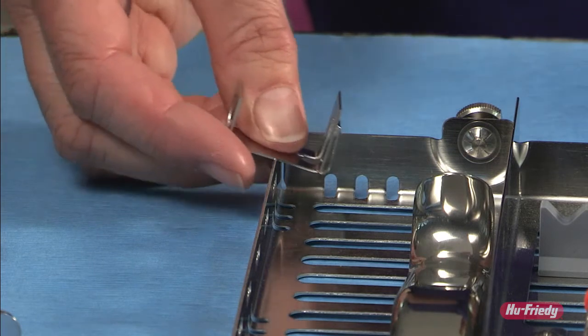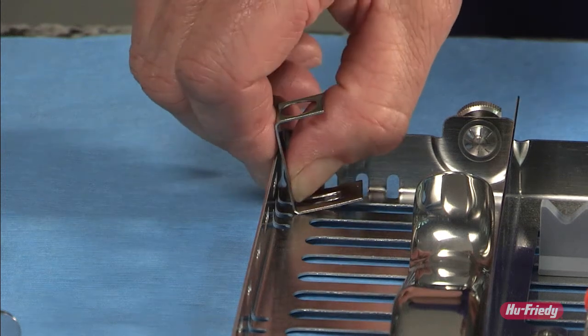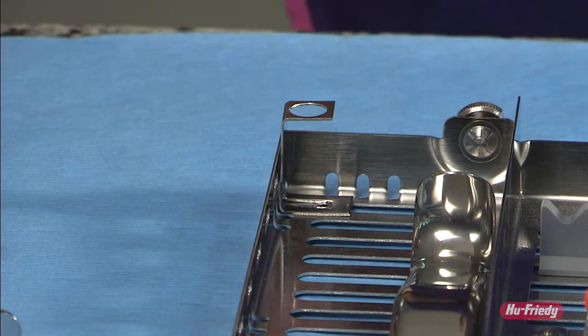Slide the flat part of the clip from the inside of the cassette into one of the curved parts of the hole. Rotate it around towards the edge of the cassette and push it towards the edge of the cassette until it clasps and locks into place along the edge of the cassette.